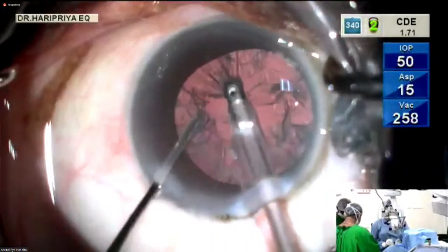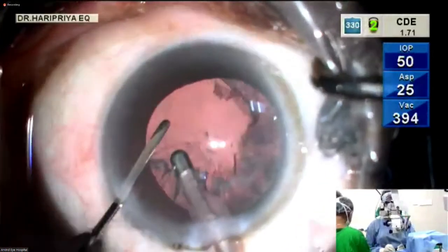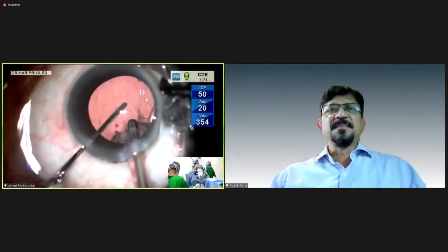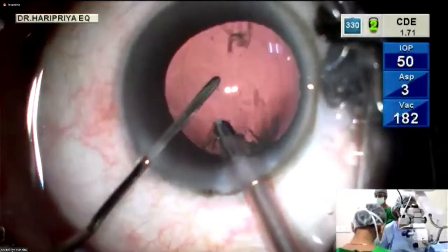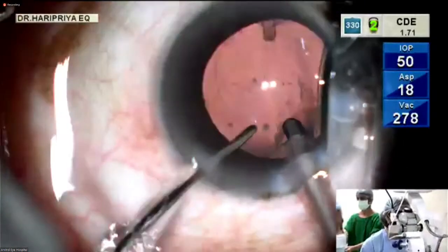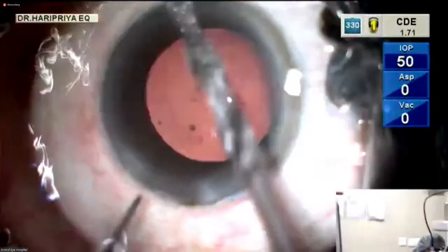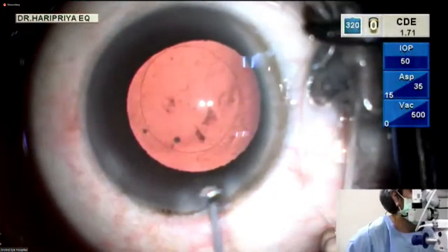This is a wonderful tip. I would like to know what exactly it does. Why do you like to do such a thing? People would definitely like to know, because in myopes, as you said, you like to lift the iris. Yeah, so I think you permit the fluid to flow. Otherwise, with the weak zonules, the iris is stuck to the anterior capsule, and this deepens. The iris will be forced to move back, and the chamber will be too deep, and the patient will also have a lot of pain. So by releasing this, you'll find your anterior chamber depth is normal, even in a high myope like this.